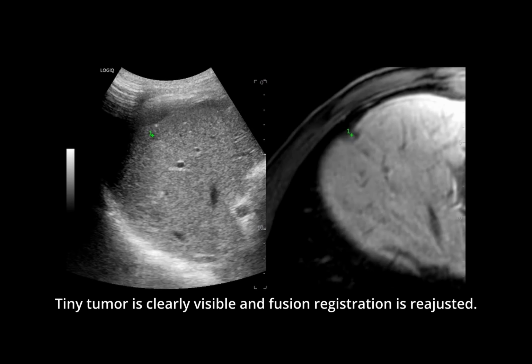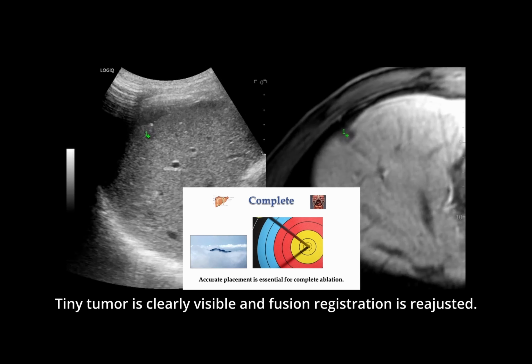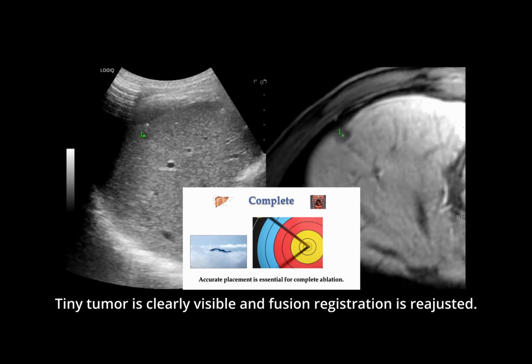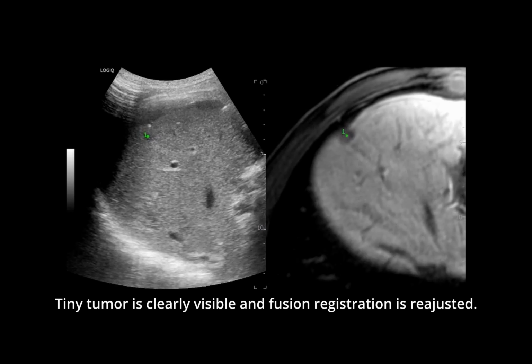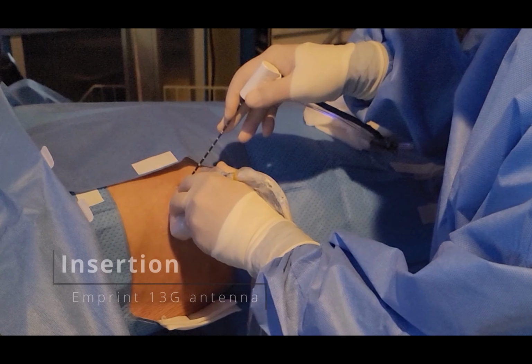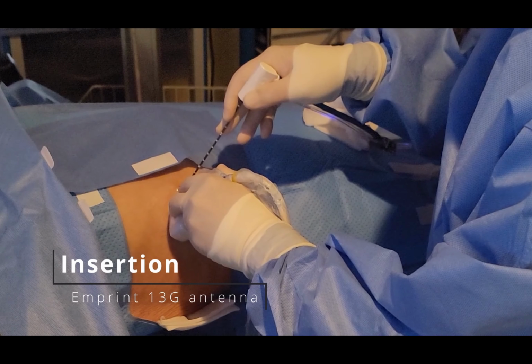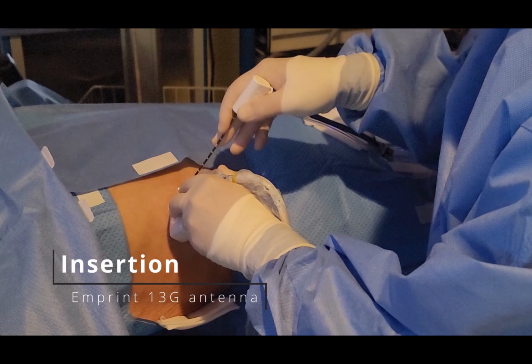You can see here such a tiny tumor, a 1 centimeter tumor, so we can insert accurately like this. Without artificial ascites, it is impossible, I think, for such a 1 centimeter tumor. And then it's time to insert the applicator. At this time, I use the imprint.